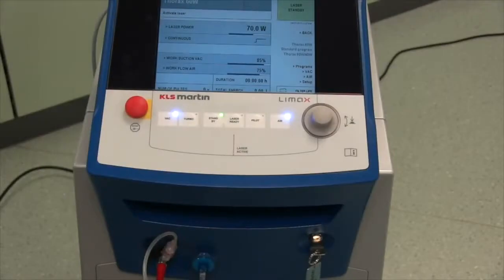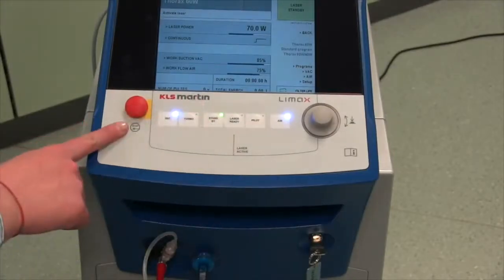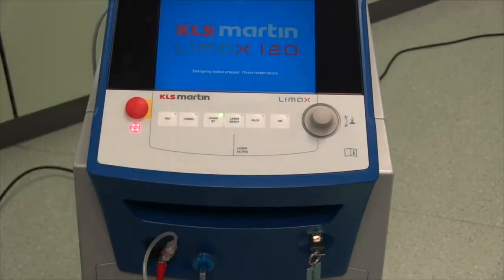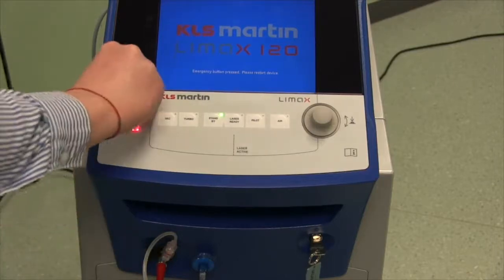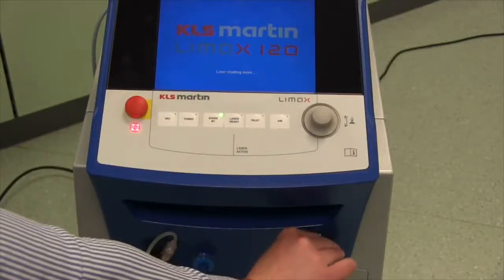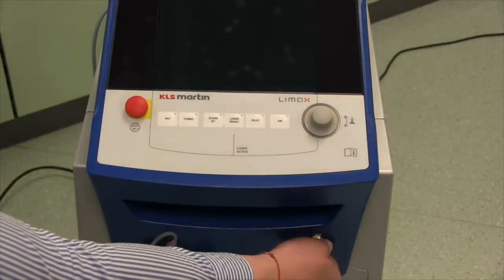In case of an emergency, press the red emergency stop switch. The laser surgery unit will shut down immediately. The emission of the laser light is stopped. When you wish to restart the laser, pull out the emergency stop switch and start the laser surgery unit as usual with your key.